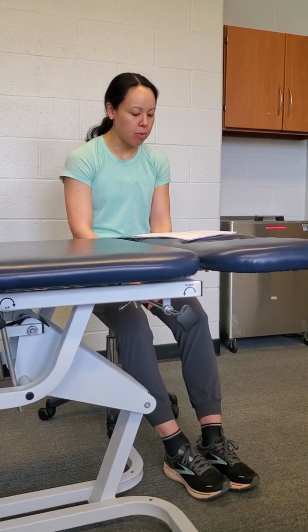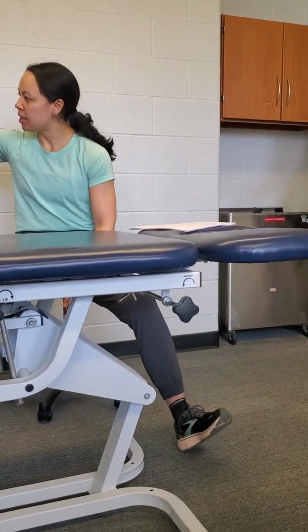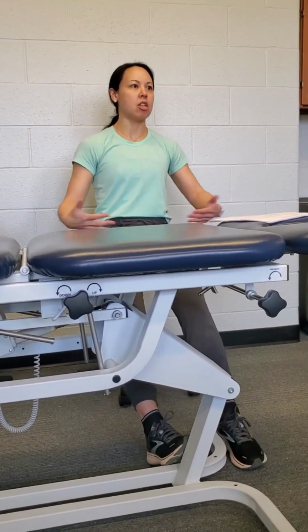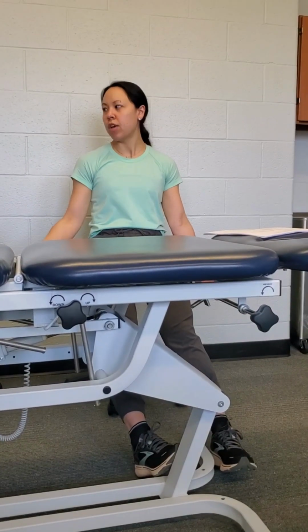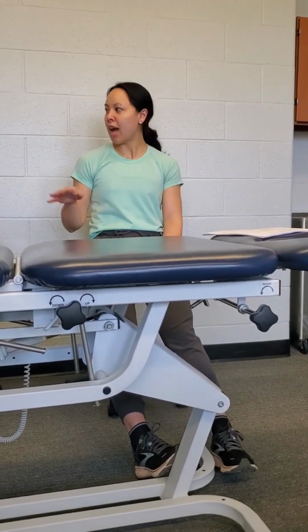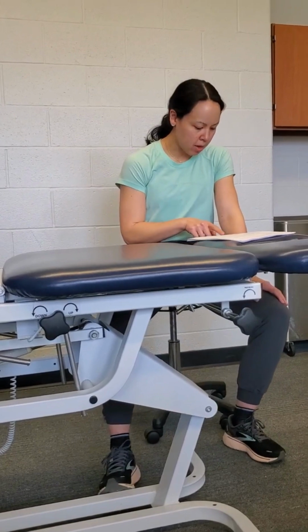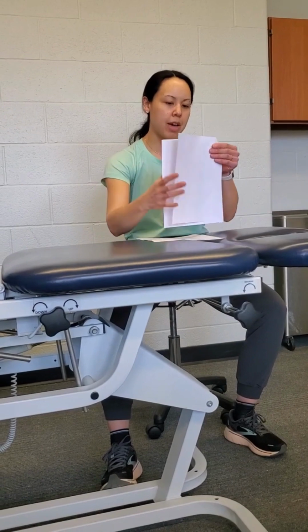And you're going to perform the Doppler every session. The Doppler is called PTP, so I believe that stands for personal tourniquet pressure. That's when I was saying, you're going to have the patient lie down. They're not going to talk, they're just going to completely relax and not move. And you hit the PTP button, and that's doing your Doppler. And then that's when you're calculating their personal tourniquet pressure, or their limb occlusion pressure. And you would record that in your documentation. That's really important to document that number.